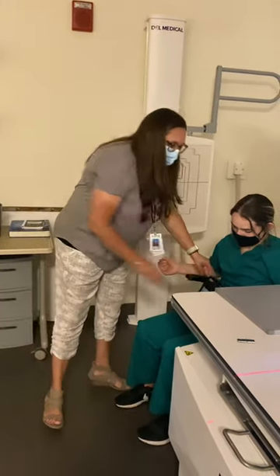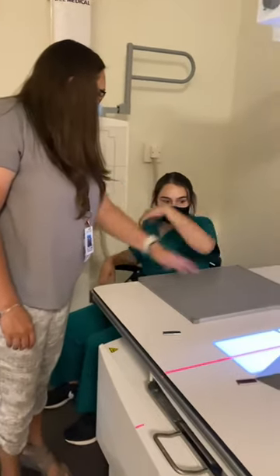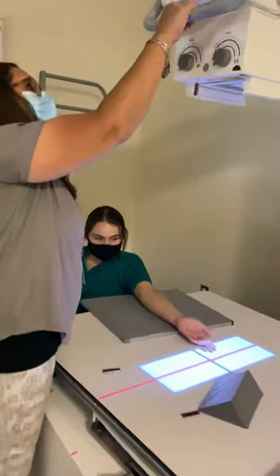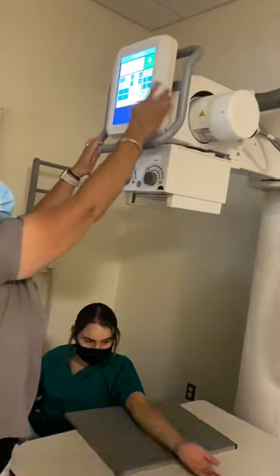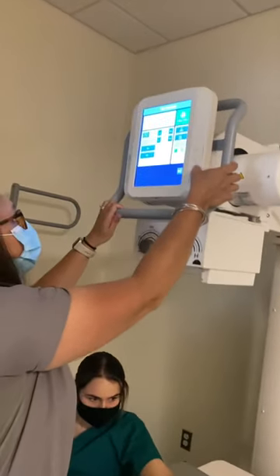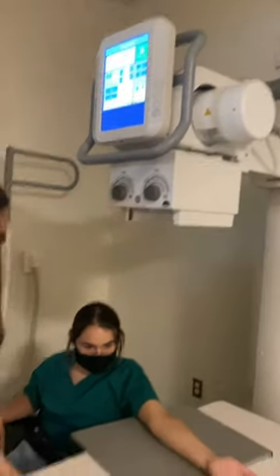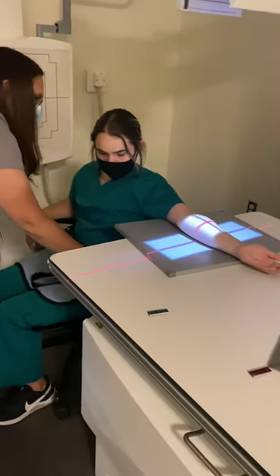We're going to put a lap shield on our patient. I'm going to have you bring your arm out, palm up, and set that right down in the middle of your cassette. There's no detent, so I'm going to click my tabletop icon and lower my SID down to 40 inches. I'm going to have to bring my whole patient forward for this one.